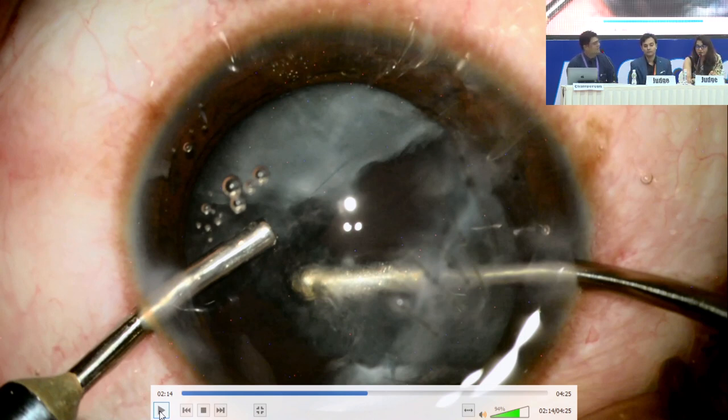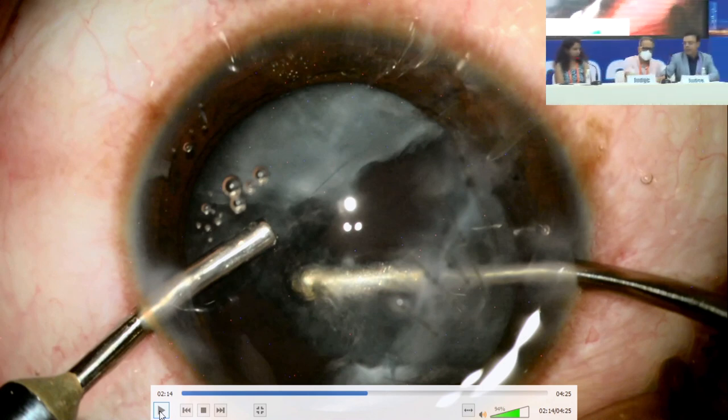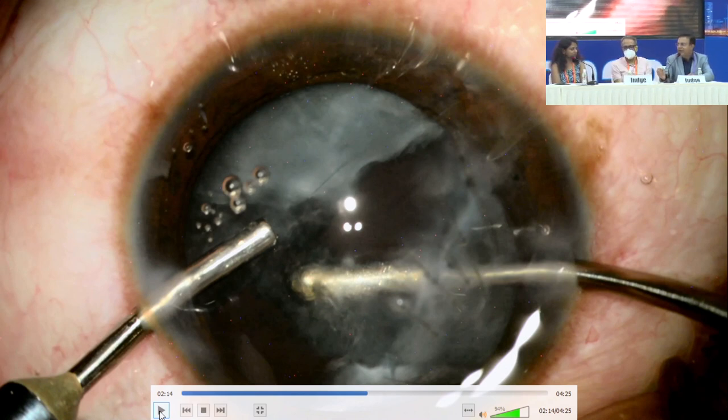So, Dr. Gaurav is here. I'd like to ask, what are the principles one should follow while doing anterior vitrectomy? What are the pertinent points which one should take care of? So I think when you have a PC break and it's either really small and you can convert it into a small rexis, otherwise you will need vitrectomy. You can't wish it away, and it should be done in a timely manner, otherwise the PC break will enlarge unnecessarily if you try to do more maneuvers at that time. So I like to go in early if I'm sure that I'm going to have to do it in any case.